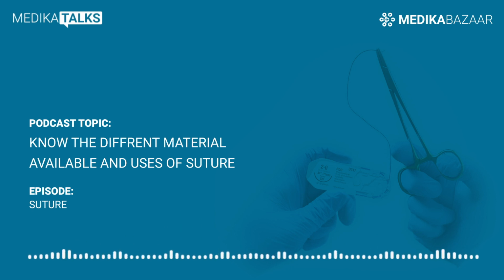The ideal suture is the smallest possible to produce uniform tensile strength, securely holding the wound for the required time of healing, then be absorbed. It should be predictable, easy to handle, produce minimal reaction, and not be easily unsecured.